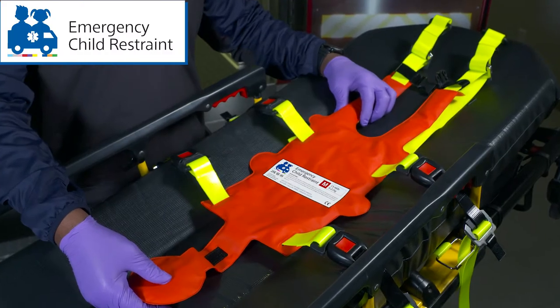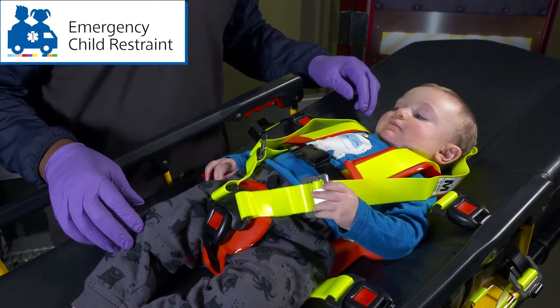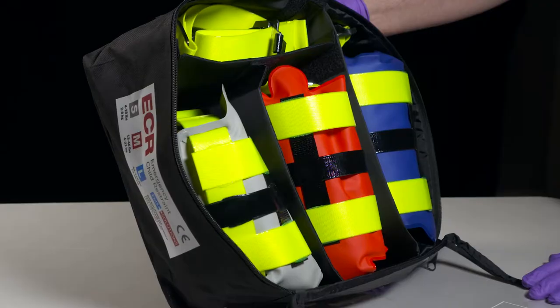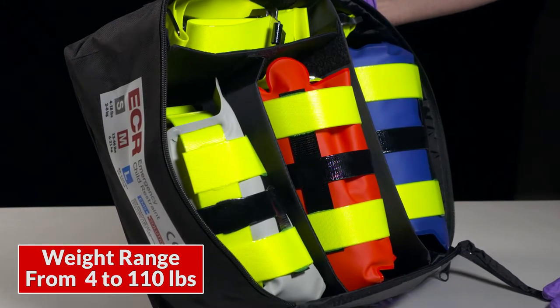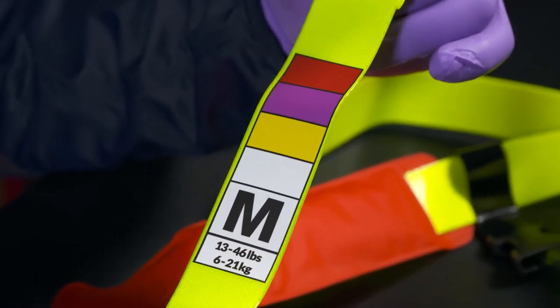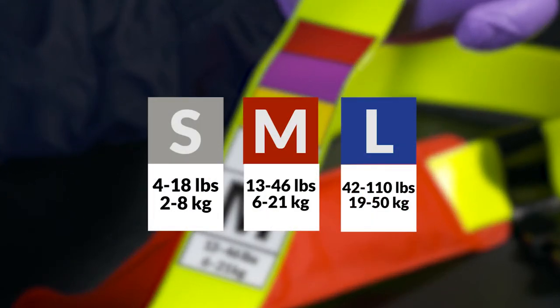The emergency child restraint is an ideal solution for securing and safely transporting pediatric patients on the ambulance cot. It is packaged in three ergonomically sized weight classes from four to 110 pounds, and each size is integrated with the color-coded pediatric Braslow system along with the acceptable patient weight ranges for each size.